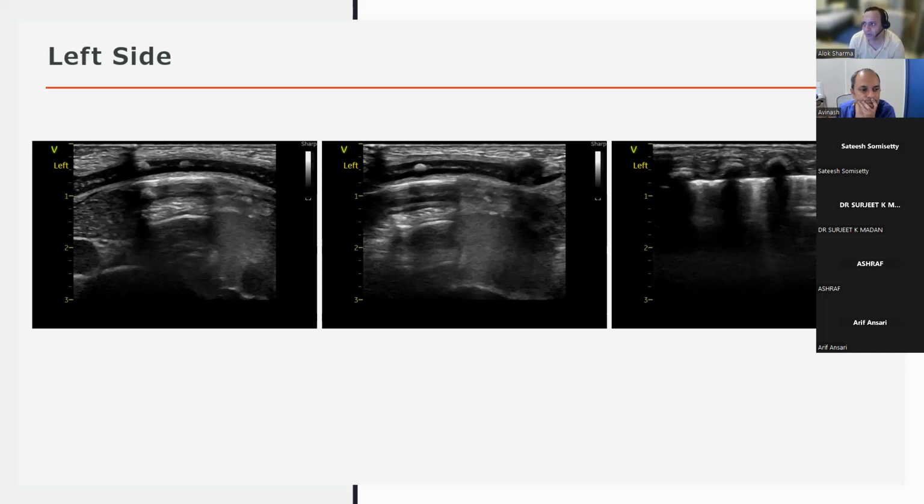So that's a beautiful question. What I'd say is this is the acute situation with a desaturating baby. If I am going to do a comprehensive scan with the baby supine, and especially with drains in, I don't want to move them. So I commonly use the posterior axillary line to look at R5, R6, and L5, L6. But I do it with the knowledge that this baby's not been turned. So if I get an increasingly wet B profile, I will clinically correlate.